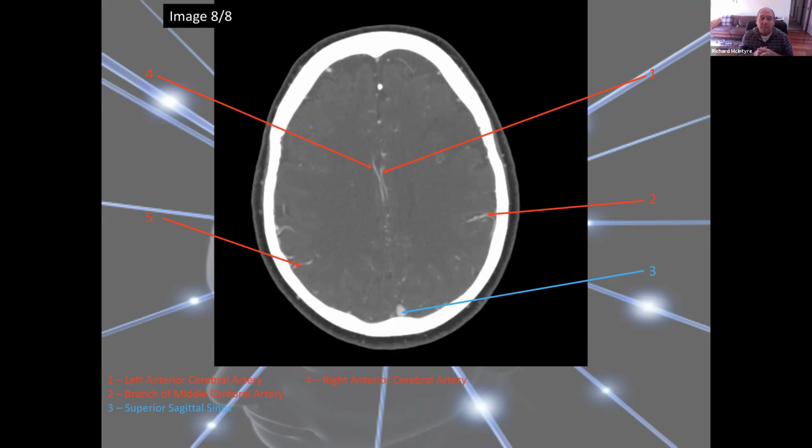Okay, however, MRI is good. We don't need contrast, so it's about a 5-minute sequence. Okay, it's like any other sequence in MRI. It's a T1 weighted sequence, and we should see the blood vessels really well because they move. But the images aren't as sensitive, and certainly not as specific to plaques and atherosclerosis, and other malformations, etc. Okay, so really good question.